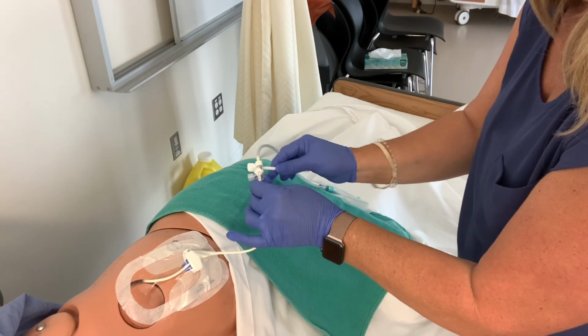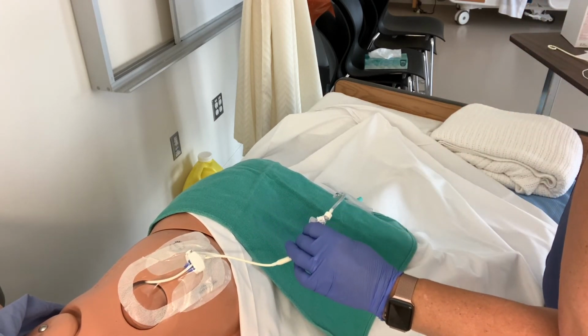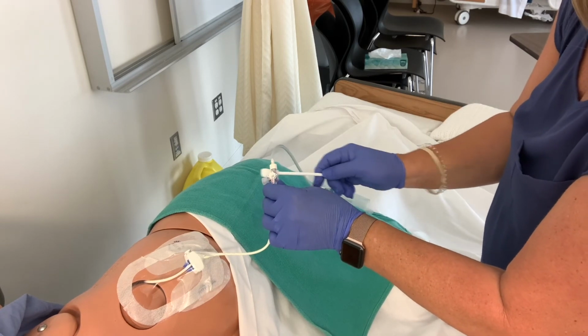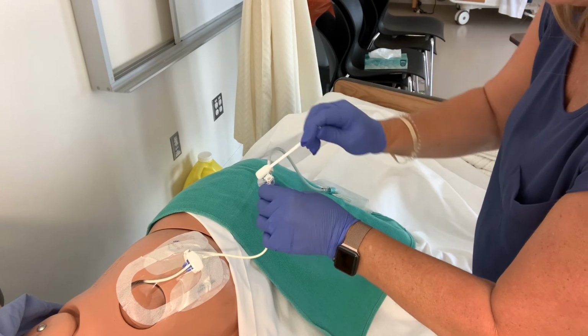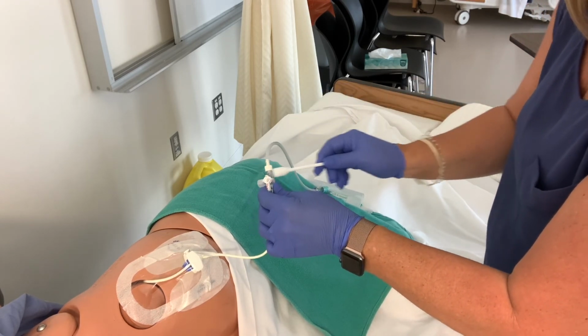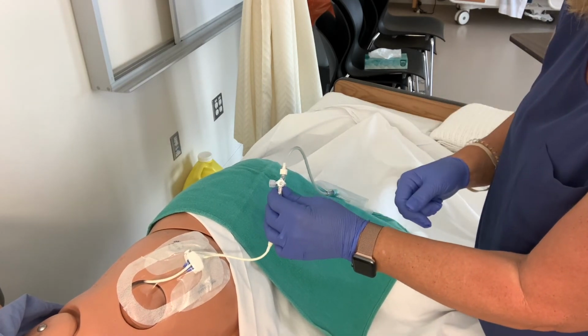I want to cleanse all of that, and I'm going to throw that one away. And then I'm going to grab a second one and do it again. So I'm going to clean all around the disconnection port site. We know the drill with chlorhexidine, it has to be allowed to dry. So I need to let that dry.